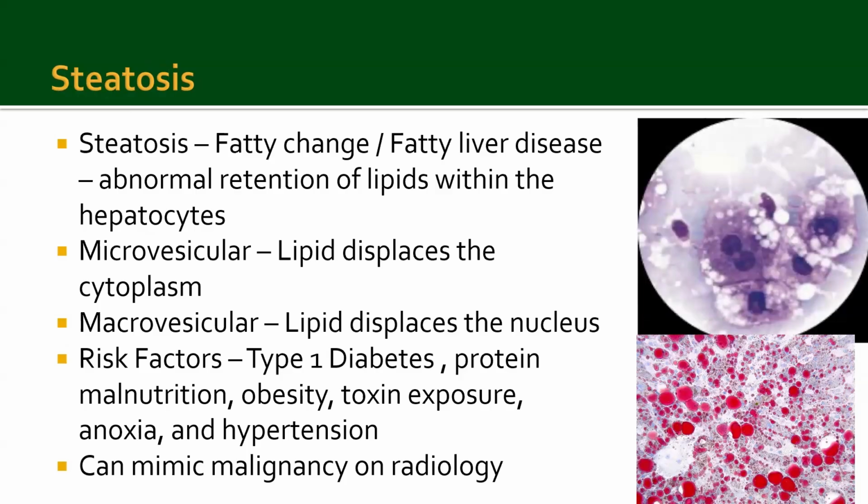Next is steatosis, or fatty liver disease, or fatty change of the liver. This is caused by an abnormal retention of lipids within the actual hepatocytes themselves, and it can be described by microvesicular or macrovesicular changes. For microvesicular, the lipid displaces the cytoplasm, and for macrovesicular, the lipid displaces the nucleus.